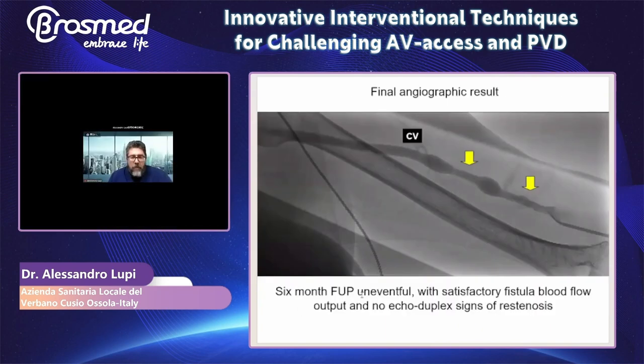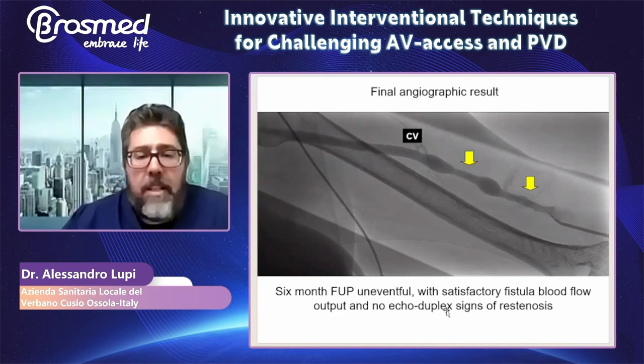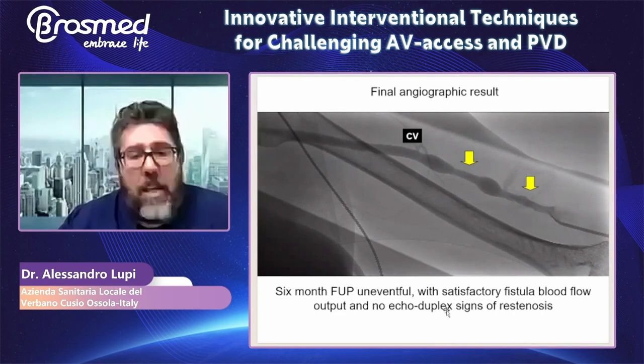We have the 6-month follow-up of this patient. The lady had an uneventful follow-up with a satisfactory fistula blood flow output and no signs of stenosis at echo-Doppler evaluation. And this is a second case.